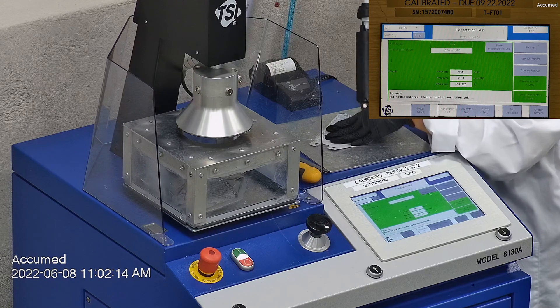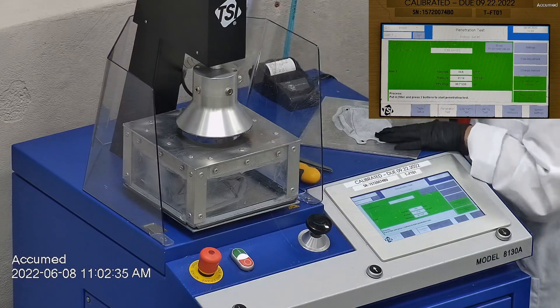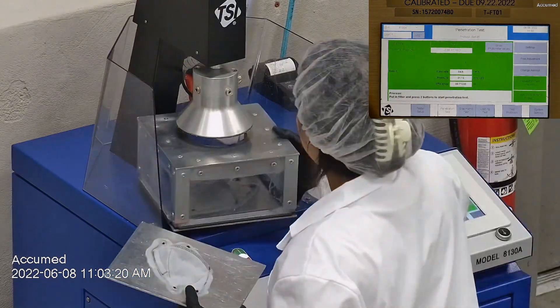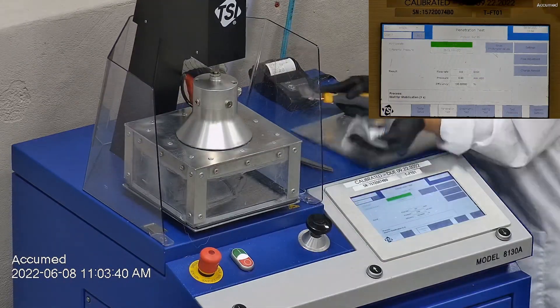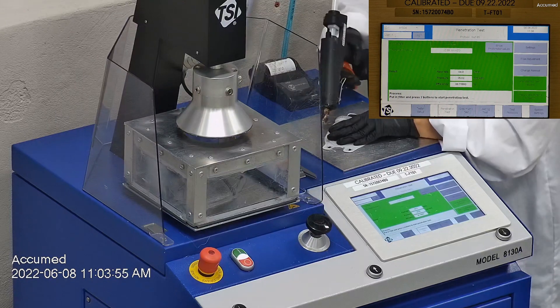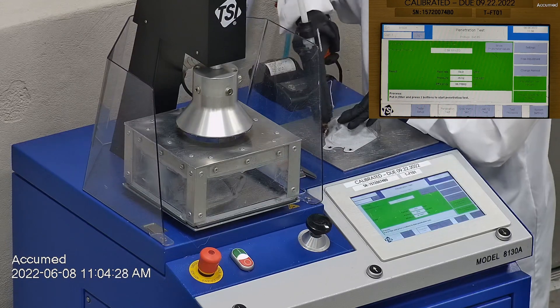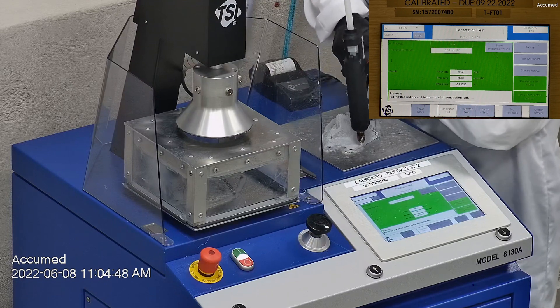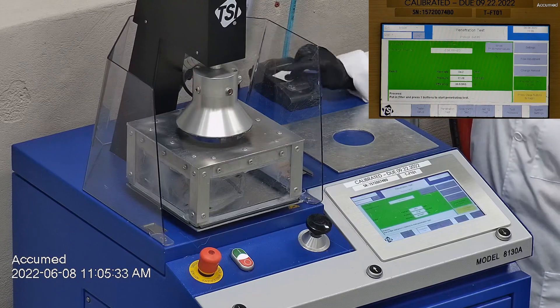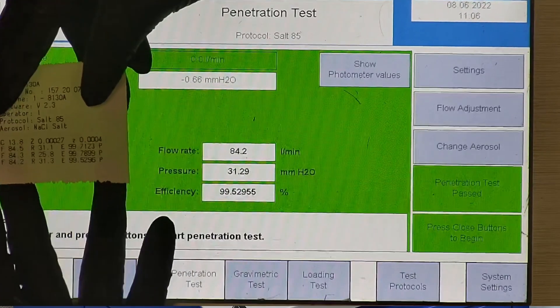The first sample tested at 99.71% filtration efficiency with a pressure drop of 31.1 millimeters of water. The second sample had a filtration percentage of 99.79% and a pressure drop of 25.8 millimeters. The last sample's filtration percentage was 99.53% and had a pressure drop of 31.3 millimeters of water.